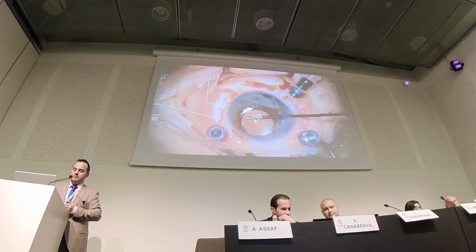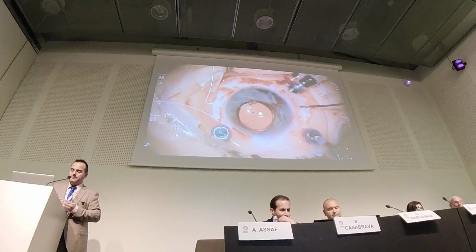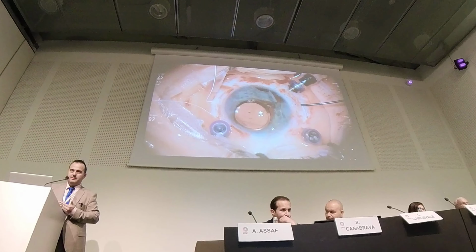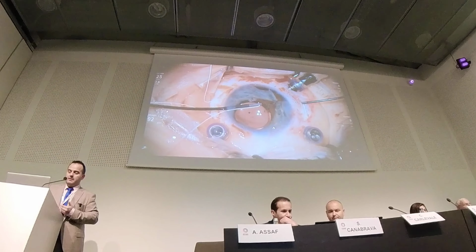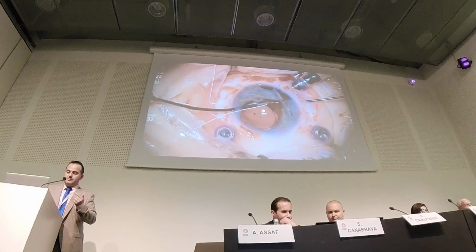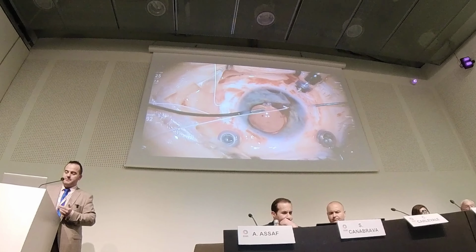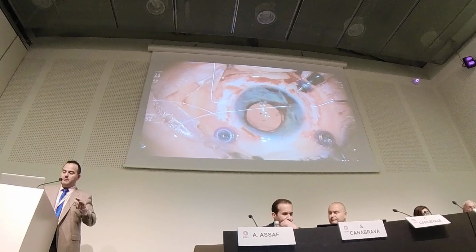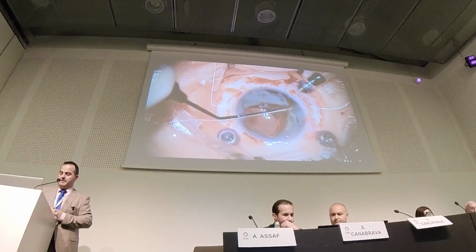You need to be careful, and the instrumentation is mandatory. If you are not prepared with microforceps, it will be more difficult. Not impossible, but more difficult. Here, with 2 side ports and a 2.2 millimeter plane incision, you can do it without enlarging the corneal incision, or without making a scleral tunnel.